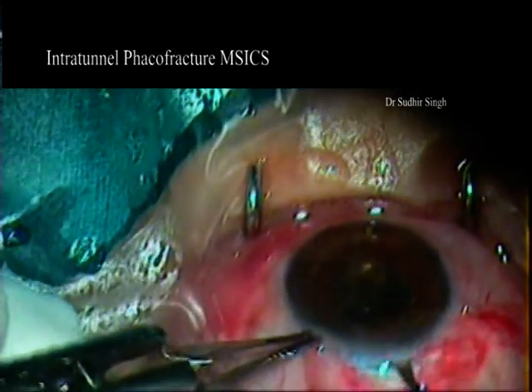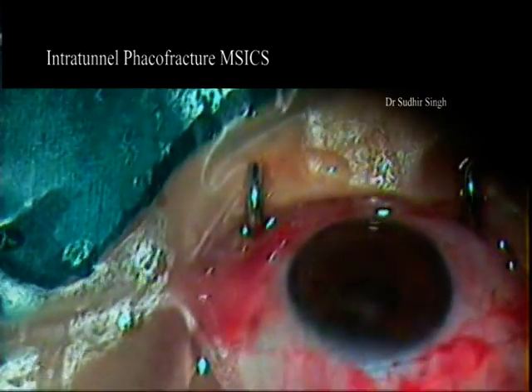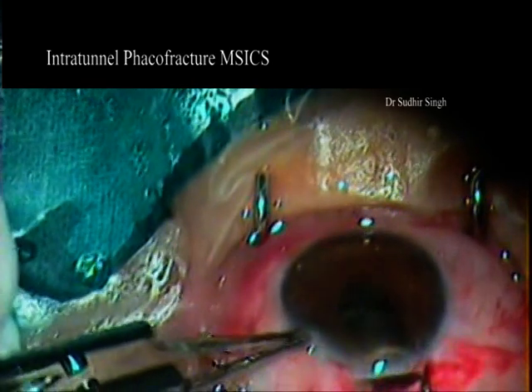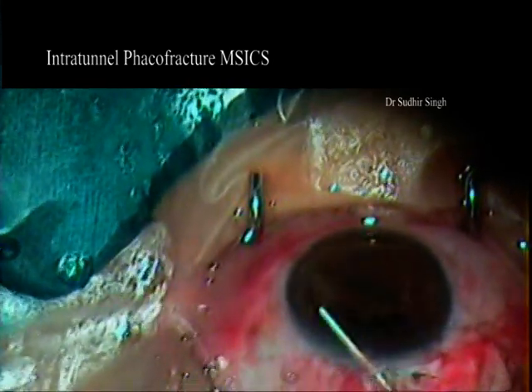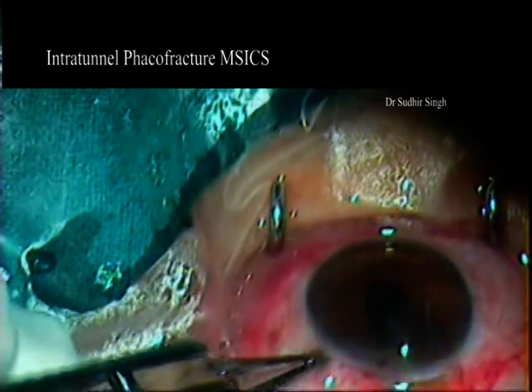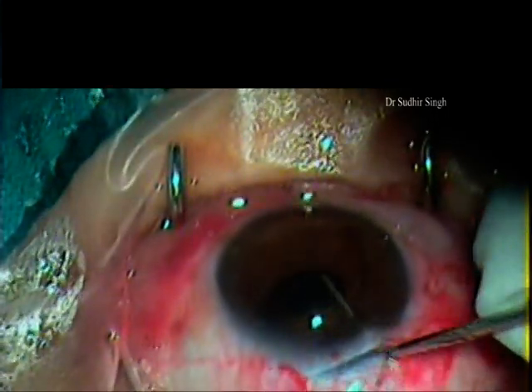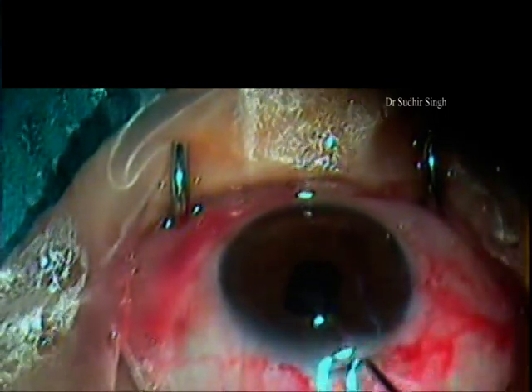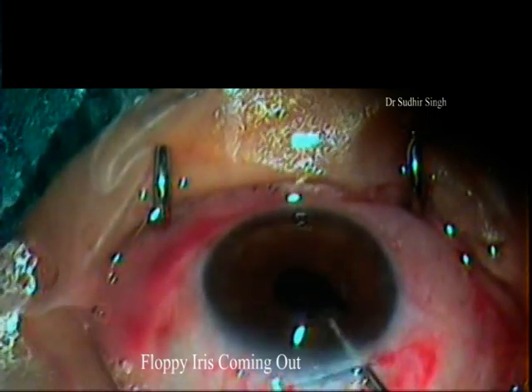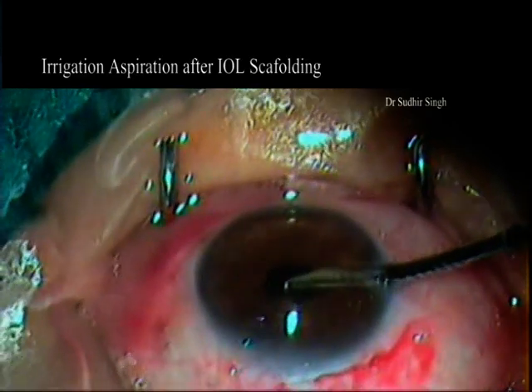The nucleus is managed by six millimeters intratunnel phaco fracture manual small incision cataract surgery, or any other nucleus management technique of the MSICS may be used as per the operating surgeon's choice. As you can appreciate, the iris is floppy in this case, so the pupil further constricted to about two millimeters. A six millimeters PMMA IOL is implanted before complete cortical cleanup. Under IOL scaffolding, cortical matter cleanup is done by irrigation-aspiration cannula carefully.